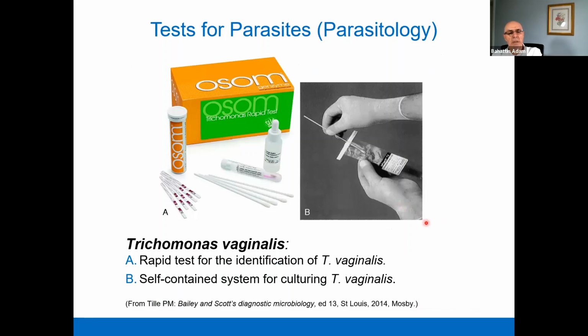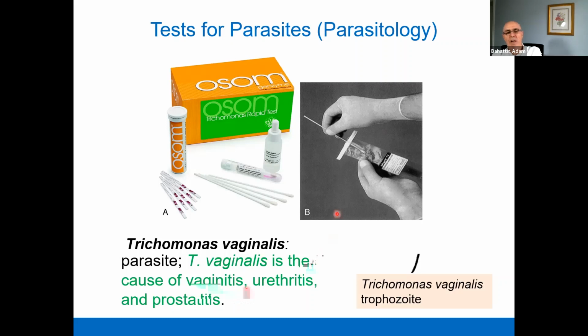Okay, there are different techniques that we are using to identify Trichomonas vaginalis. A rapid test for identifying it, as is here, the self-contained system for culturing Trichomonas vaginalis.